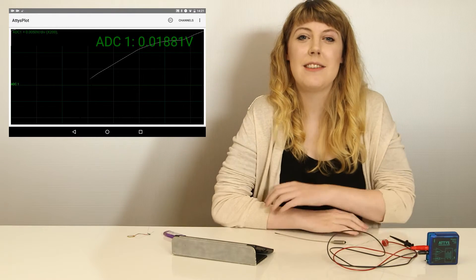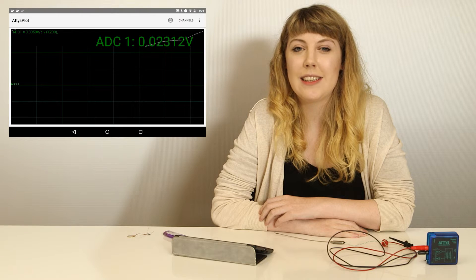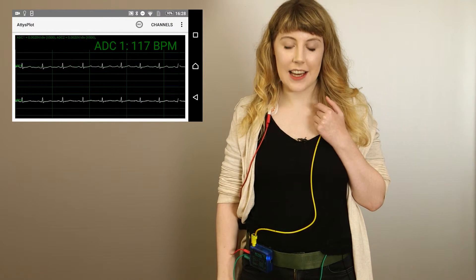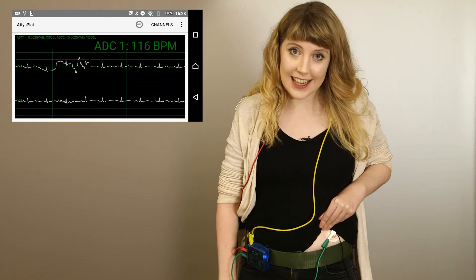Now let's measure something in the region of 1 millivolt — my ECG. That's the ATIS set up for recording two ECG channels. The one is placed between my shoulders, the other between my left shoulder and left hip.